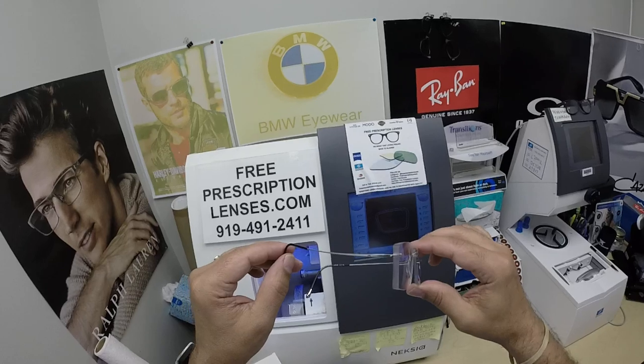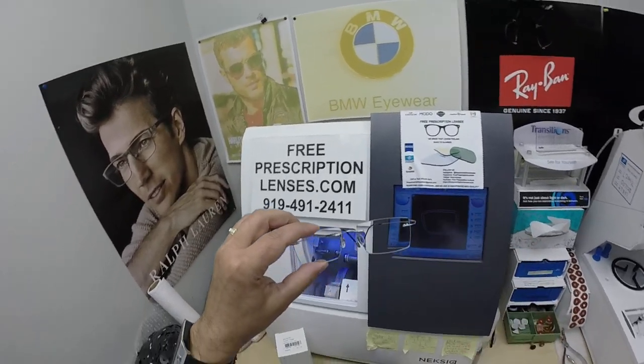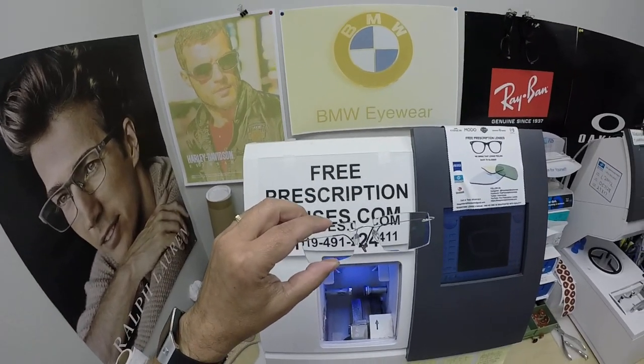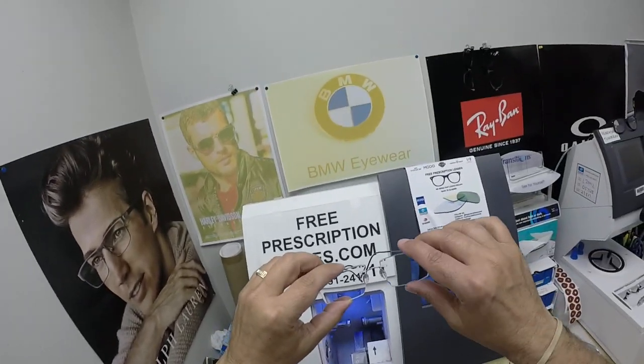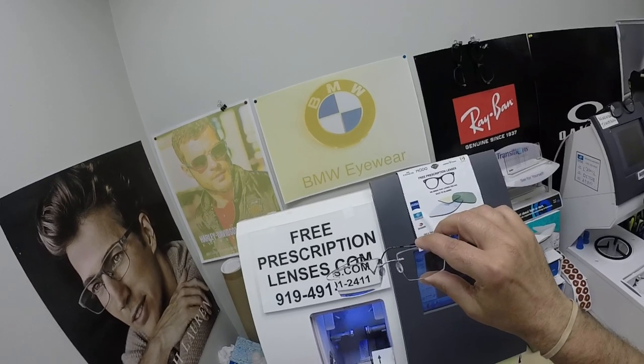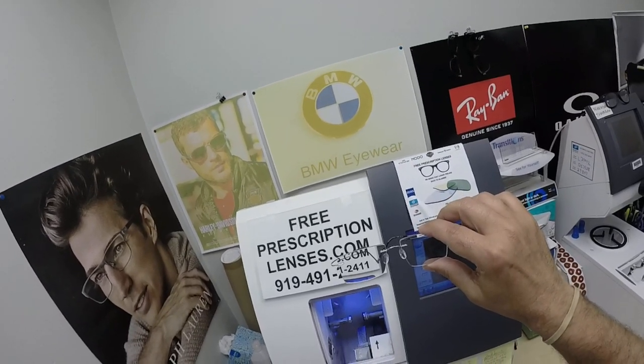He got the silver color, although this does come in a green — almost a lime green. I'm an authorized Silhouette dealer. I do not have this frame, this chassis, the 5515 or the 5521 on the website. Those are the two drill mounts I do the most.